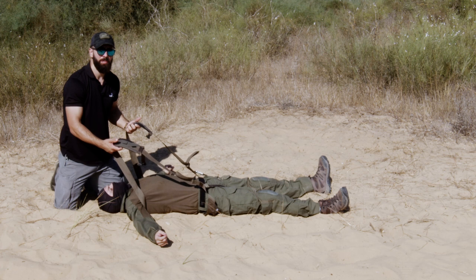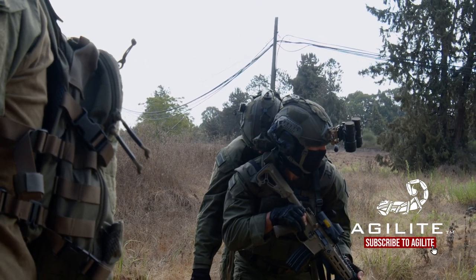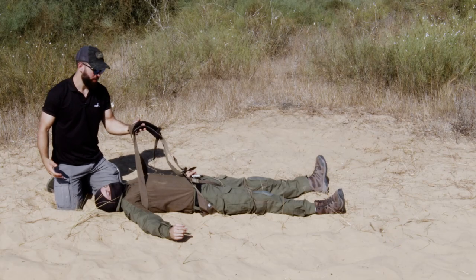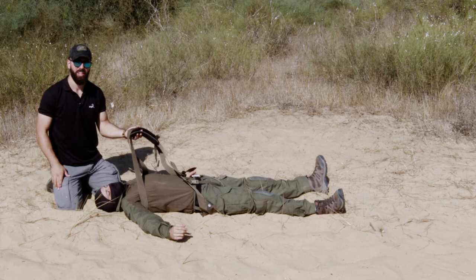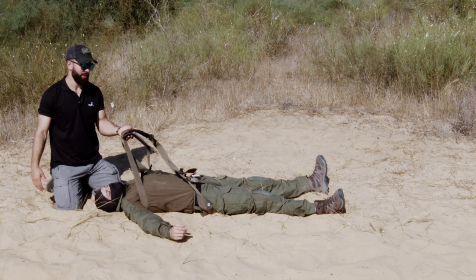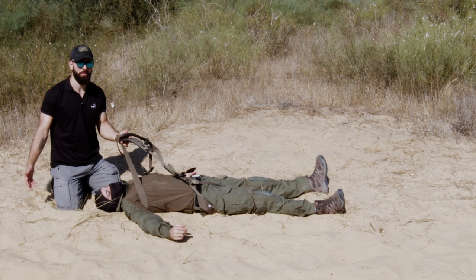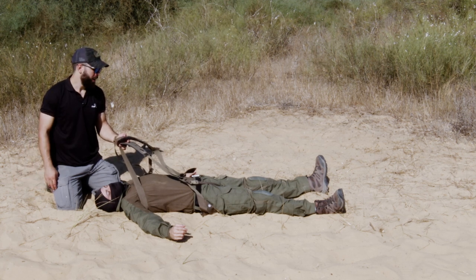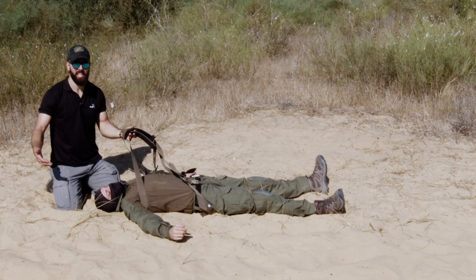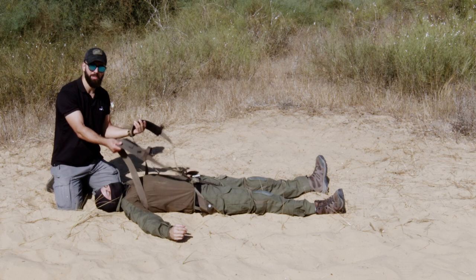You guys in the military are going to be used to carrying heavy backpacks — and this guy is one heavy backpack. Now I'll show you how to lift someone from the prone position or from a standing position. I recommend starting with the standing position and then moving on to prone. The standing position is also great for people with a leg injury who can still stand for limited periods. You can also do switches between carriers — carry for a few kilometers, then switch to someone else while the person is just standing.